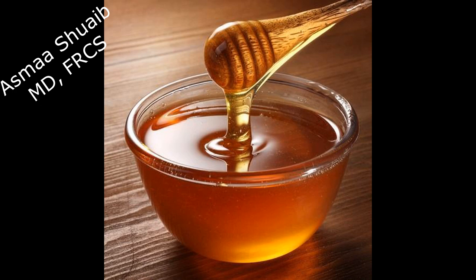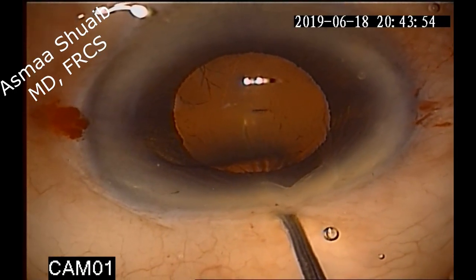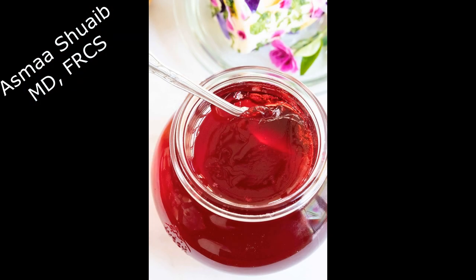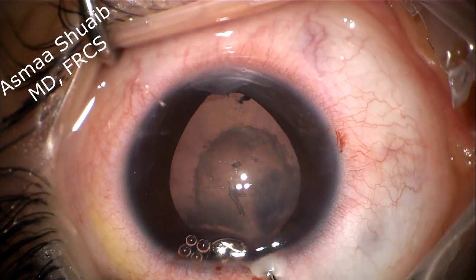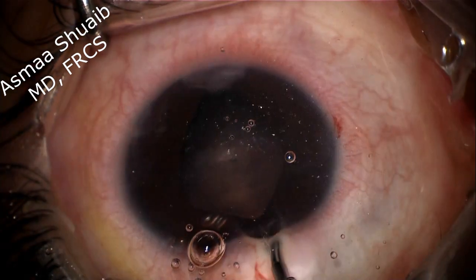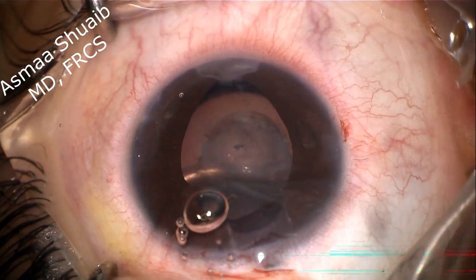Let's see the removal of a viscodispersive material. And now, let's see the removal of a viscocohesive material. It moves outside the globe as one block. So, it is easier to be removed if compared to the viscodispersive material.